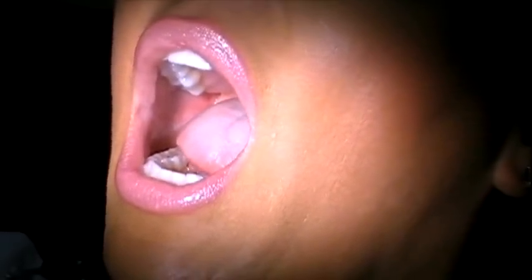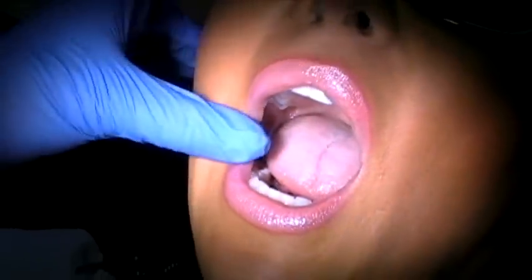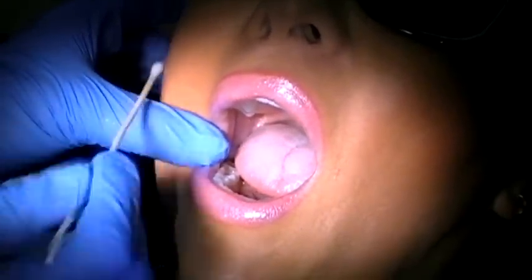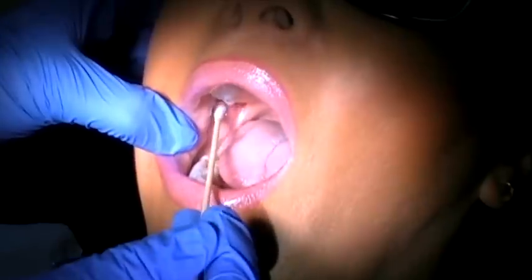I'm going to demonstrate the Gow-Gates injection today and go over the landmarks. The first landmark is the line from the intertragic notch to the commissure — that line right here — which gives you your angle for when you go in for the injection.